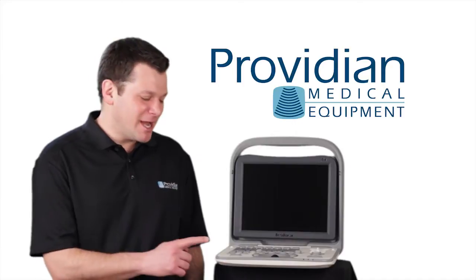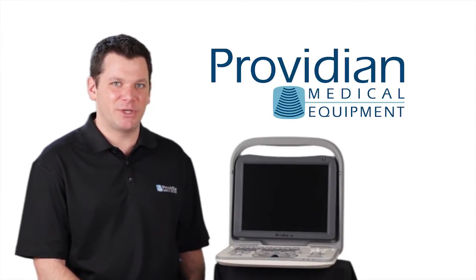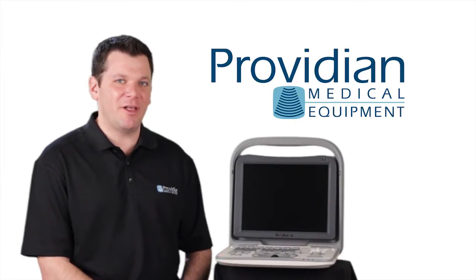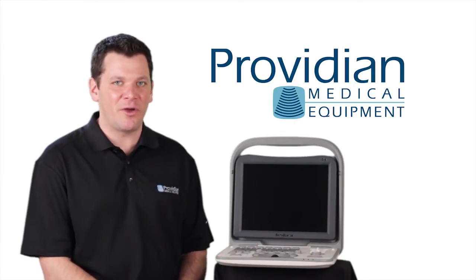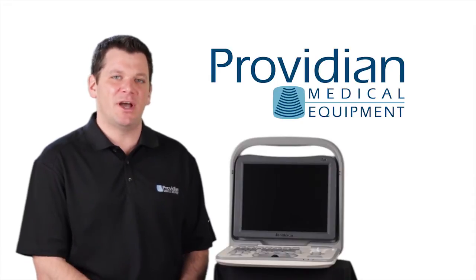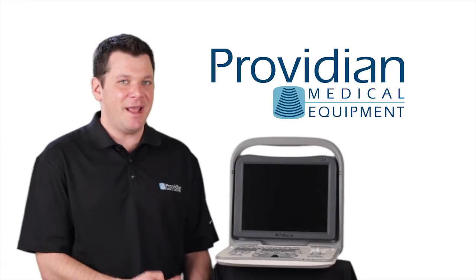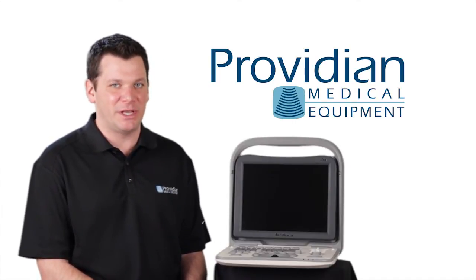Hi, I'm Brian Gill with Providian Medical, and this is the Sonoscape A6 portable black and white ultrasound machine. When we took a look at this, we really liked it a lot. It is a big improvement over other black and white portable ultrasounds in its category, and it really shows off what they've been doing lately with the user interface, image quality, and keeping the price point low on portable ultrasound machines.